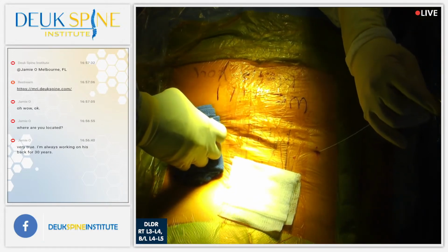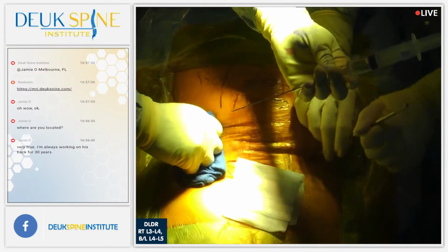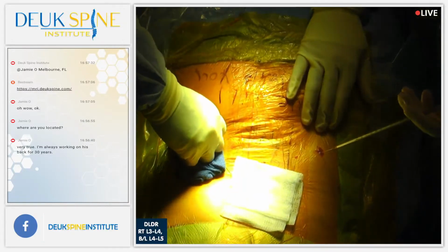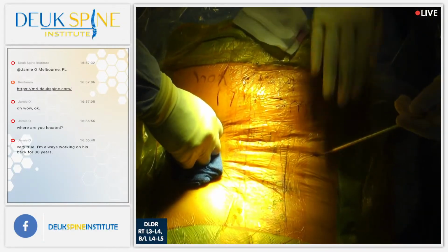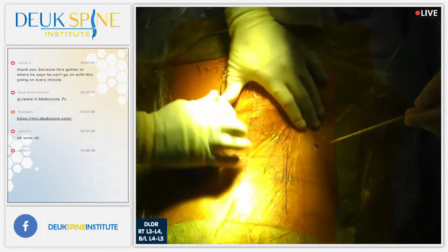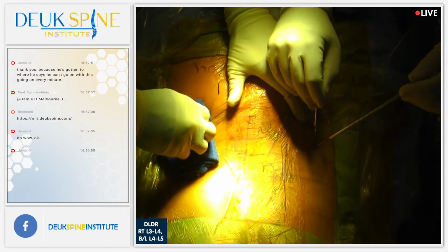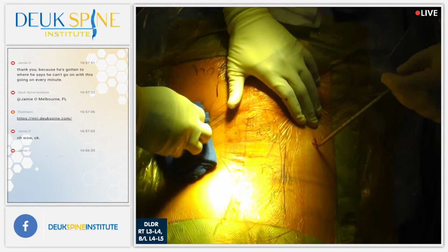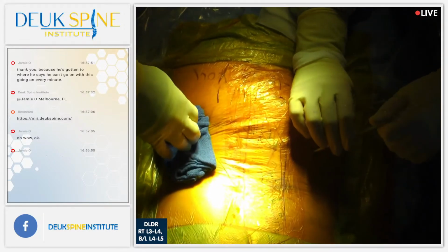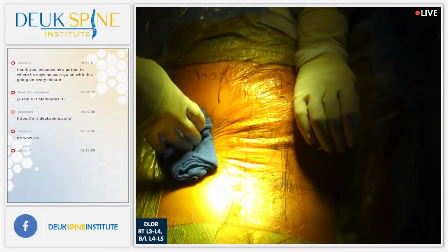Some numbing medicine for Dr. Berndes. Let me have a skin knife. Will you pull this here? What happens is there's a little skin tag. Numbing medicine. Shot. Any other questions? No current questions.